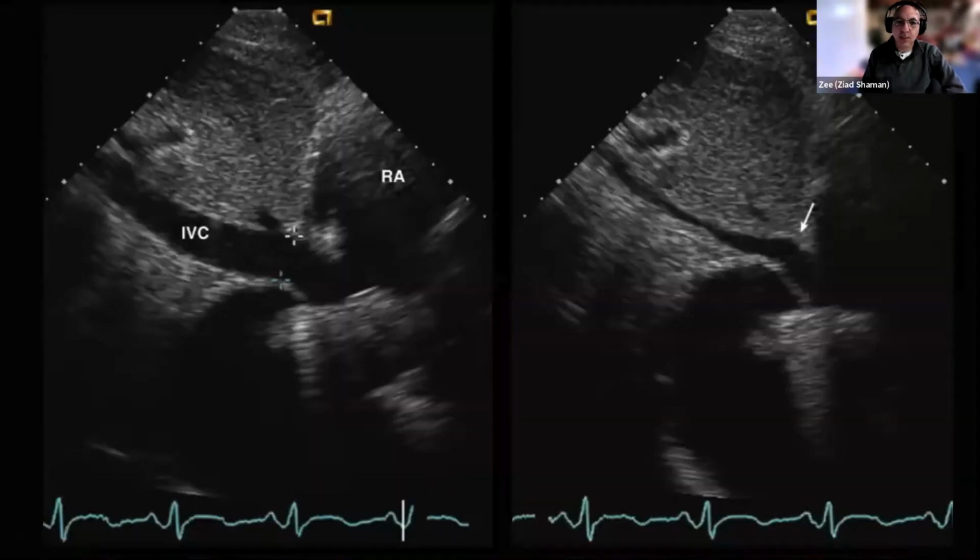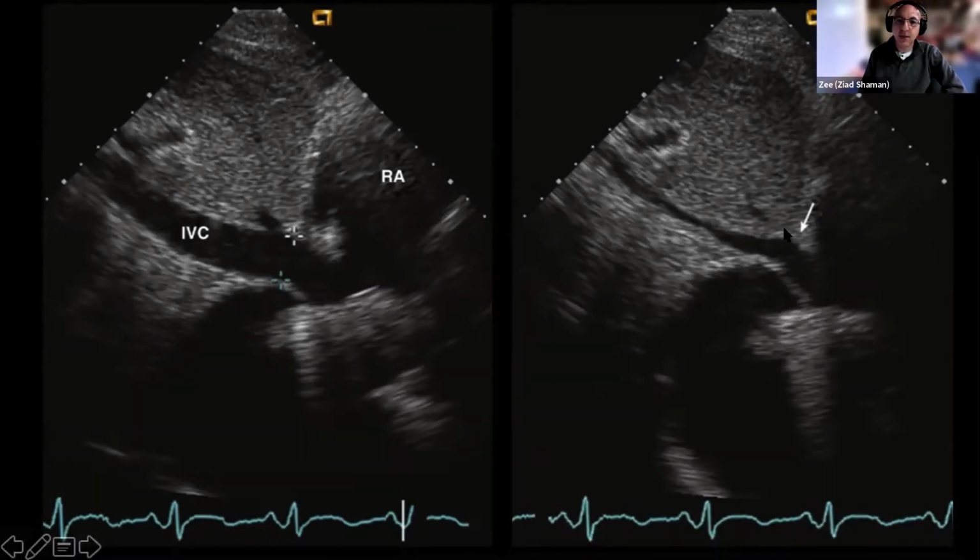And from this, you're going to measure the size of the inferior vena cava, the diameter, and also the variability with inspiration. And the variability with inspiration is a little bit tough, because you can have a patient taking a big breath or sniff, and they generate a -100 intrathoracic pressure, and someone who would generate only -10. So there are two ways to do this, either with tidal breathing or with a sniff, which I will come to when we talk about the algorithm.